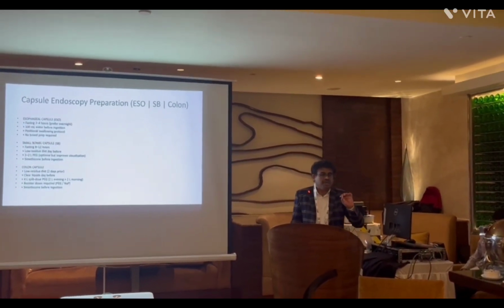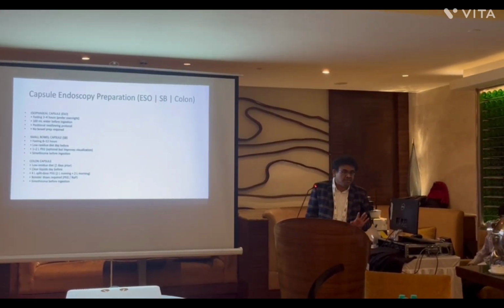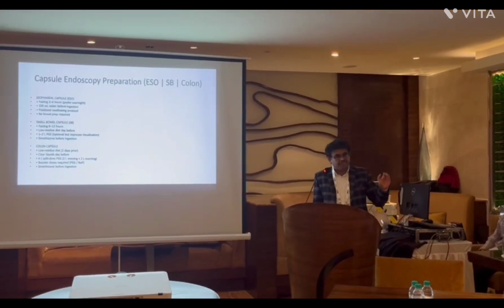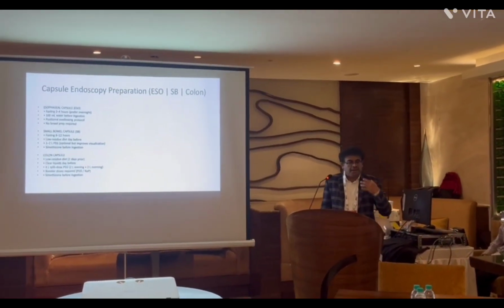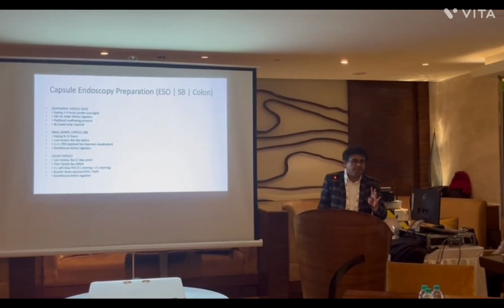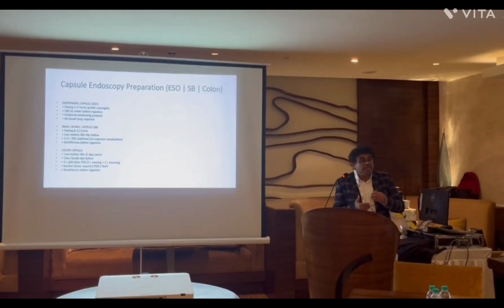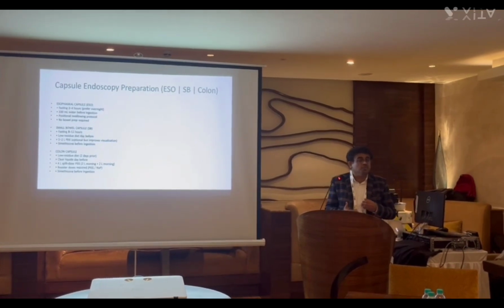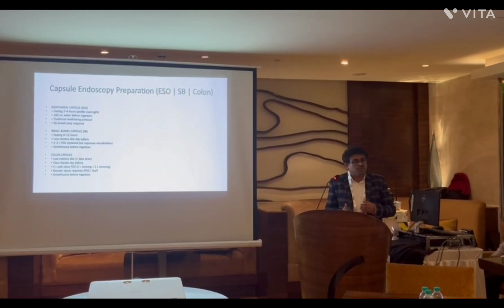Colonic capsule is always a difficult task. In the small bowel capsule, once it reaches the cecum, the study is almost complete, and there is no intention to look for complete excretion, because complete excretion takes 24 to 48 hours, or up to 72 hours in some patients depending on viability. But for the colonic capsule, the bowel preparation should be aggressive. We need to give 4 liters of bowel preparation and make sure the cardiac status and everything is checked. During the procedure, after 6 to 8 hours, we can augment with what is called booster preparation: another sodium phosphate or 1 more liter of PEG solution.